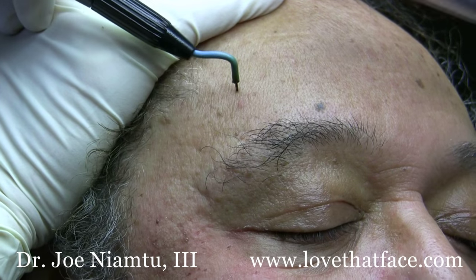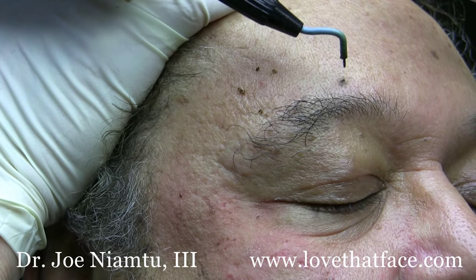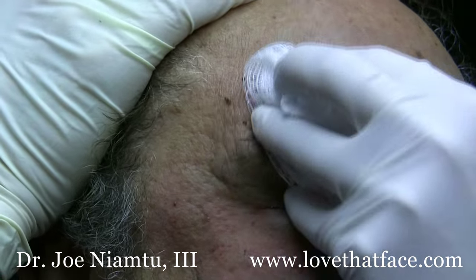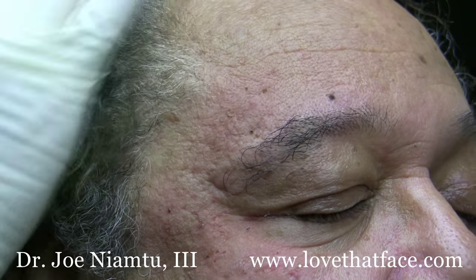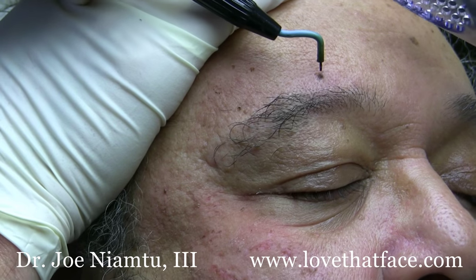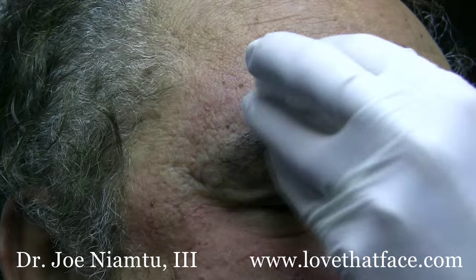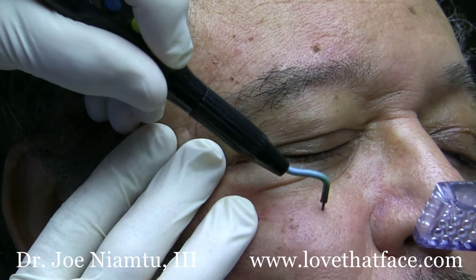Sometimes I'll sedate somebody and do hundreds of these at one time, or more often people come in and do a handful at any given time and return on a regular basis until they're happy. Many people don't want all of these gone, just the biggest ones. Cosmetically, it's possible you'll remove the lesion and still see a little area of brown spot, as I'll show you in some before and after pictures. These lesions do really well and patients are extremely happy — this is a great way to treat DPNs with the Elman 4.0 megahertz radio wave surgery system.